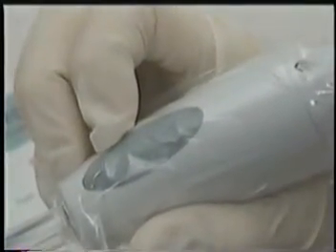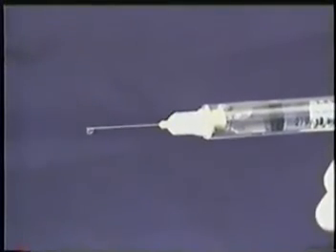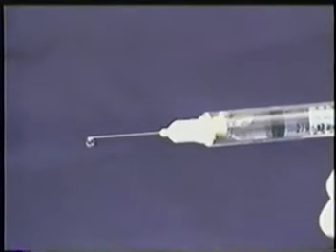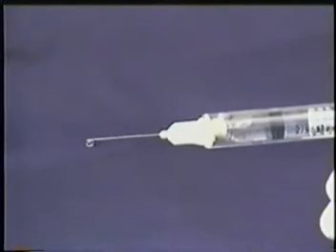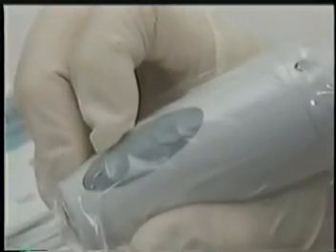After negative aspiration is achieved, press start to initiate the injection. You can see the slow rate at which the anesthetic is delivered. This rate lasts 10 seconds for patient comfort. Then the injection rate automatically increases to the pre-programmed or regular phase for the injection type selected. You may stop the injection at any time by simply pressing stop.